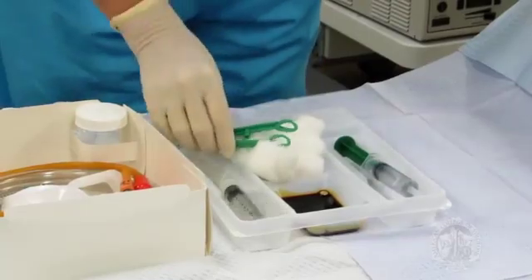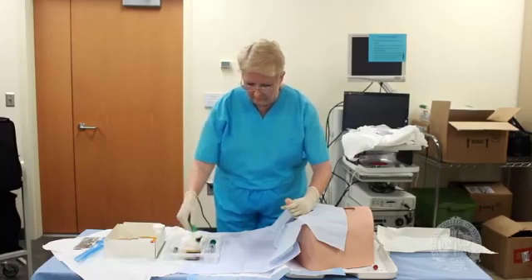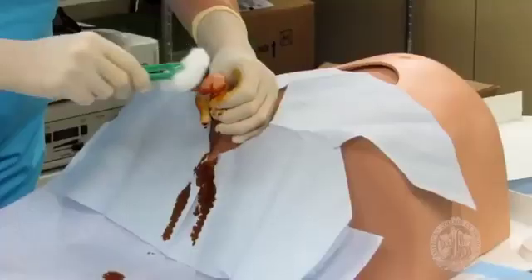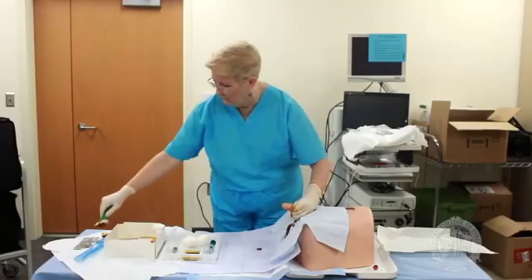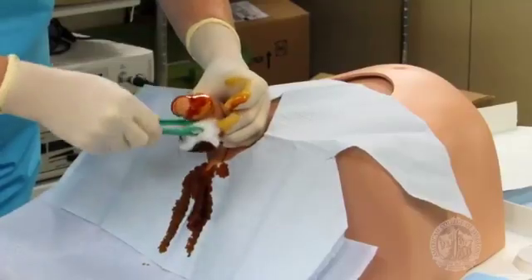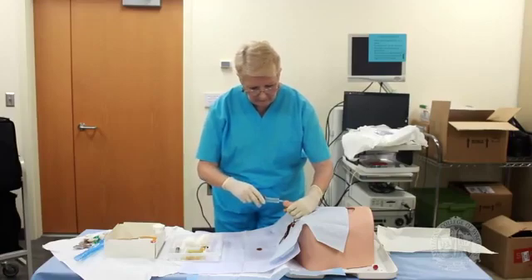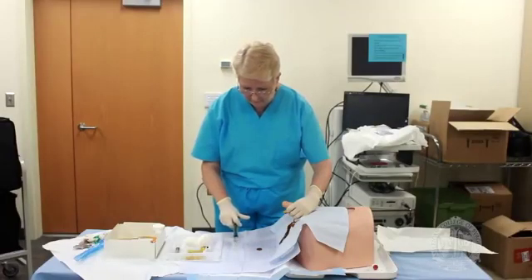Next, open the syringe with the sterile water as well as the syringe with the lubricant. Hold the shaft of the penis in your non-dominant hand, retracting the foreskin if it is there. If you are using your left hand to place the catheter, stand on the patient's left side. Your non-dominant hand is now contaminated and cannot assist in placement until the catheter is in place and the balloon is inflated. Pull up on the penis — if your grip is not tight enough, placement will be difficult and can lead to unsterile placement. Using three cotton balls, prepare the glans from the meatus towards the shaft in a circular motion. 2% lidocaine jelly can be injected directly into the lumen of the urethra via syringe, and squirt the rest of the lubricant onto the sterile field.